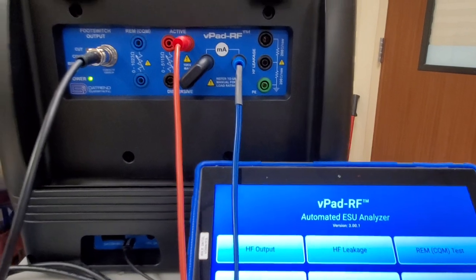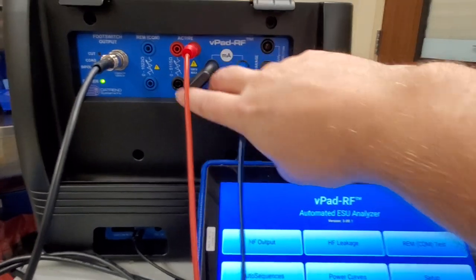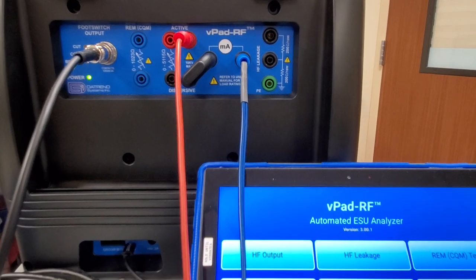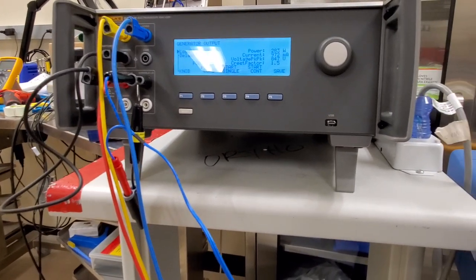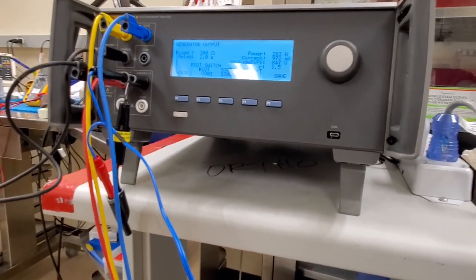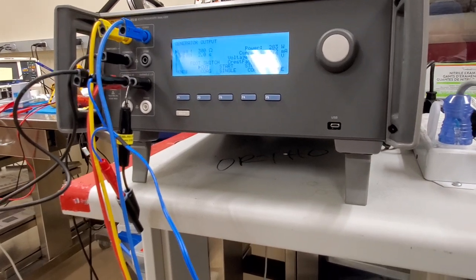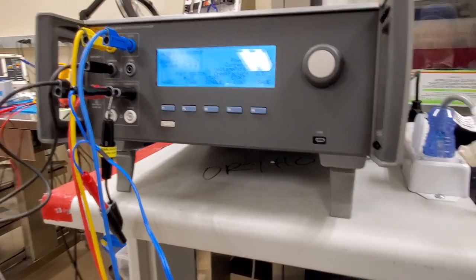Daytrend, you guys really dropped the ball. Your interface is somewhat reasonable, although you could do a better explanation with the color coordination. During the test you've got to move these jumpers around - it's a complete pain. On the new Fluke, look at all those wires. I need all those wires connected just to do a simple monopolar output test. Are you going to memorize where all those connections go every single time if you do these once a month or once every two months? I don't think so.